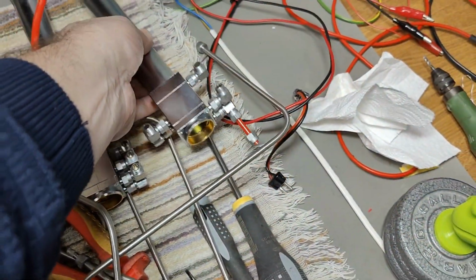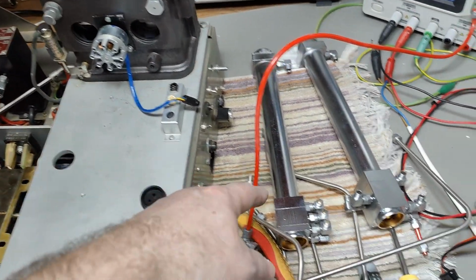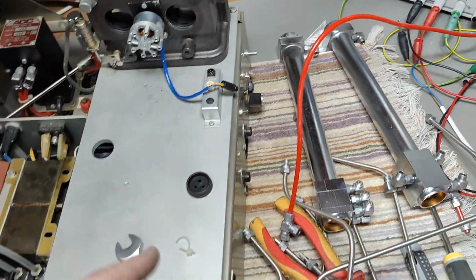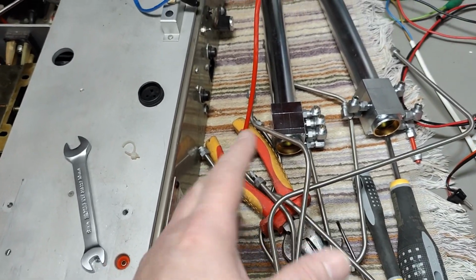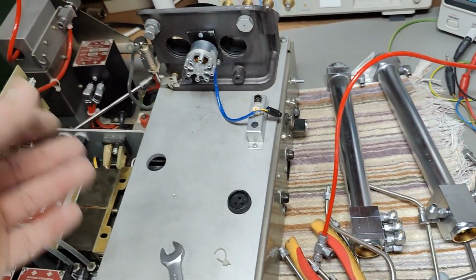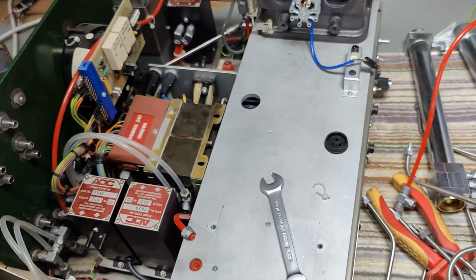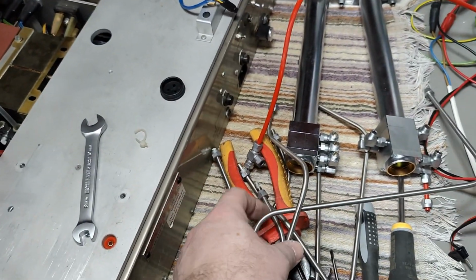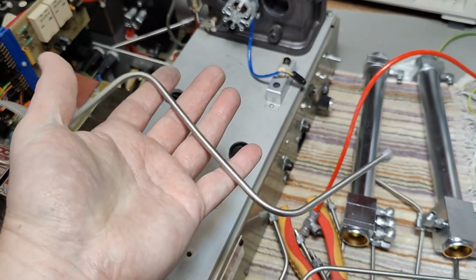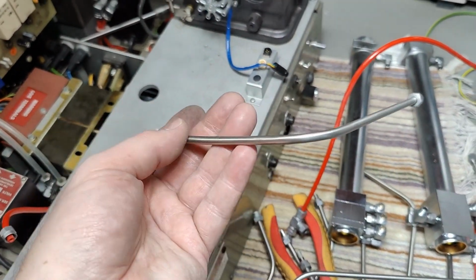So what it's going to do, it's cranking up the drive level, right? Until there is a signal. And when this one is blocking half of the signal, I mean, of course you're going to blow up the emitter, and then the detector can't see anything. So that is definitely a main service required, and then they of course just threw it out. Also, it's just very, very old and useless today. But anyway, it's quite interesting to see how it was built. The fun thing about these stainless steel, this is all the piping and all that kind of stuff, they weigh absolutely nothing.